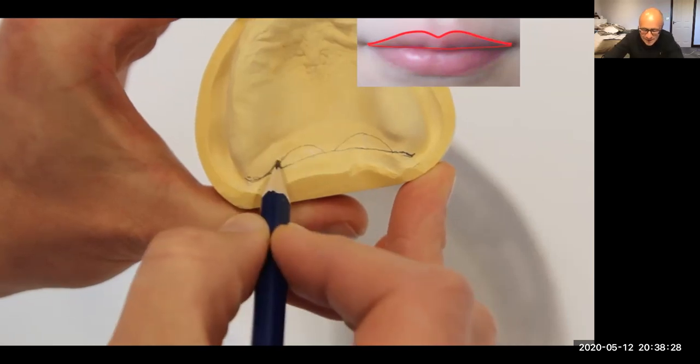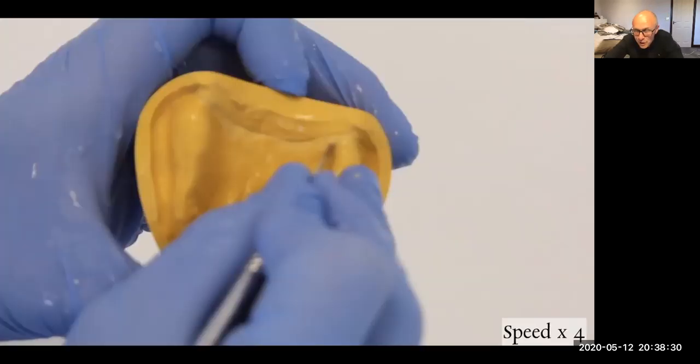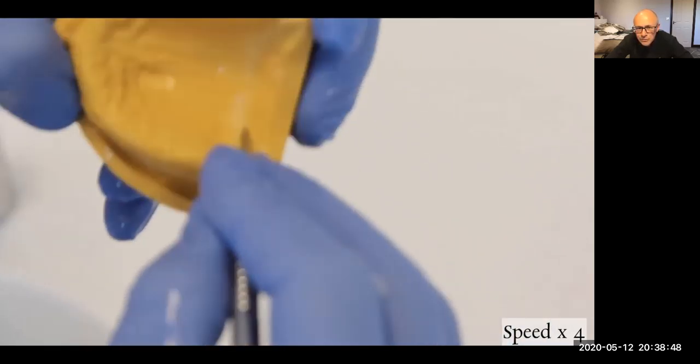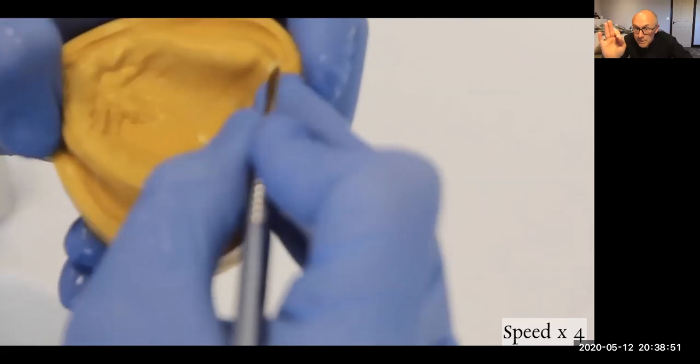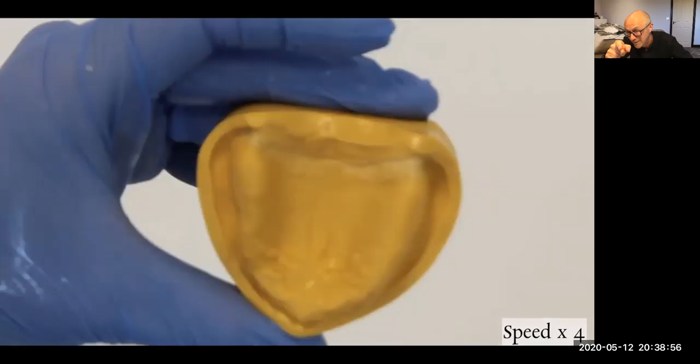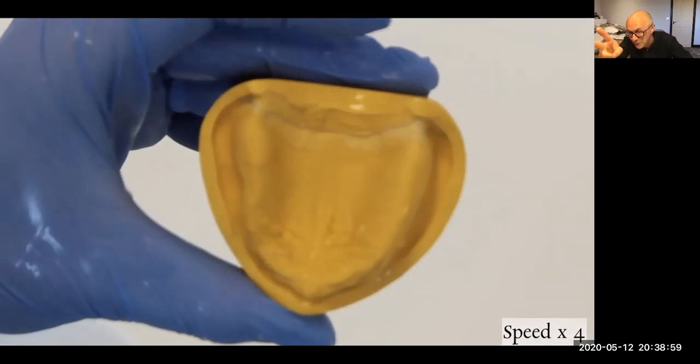So once I've done that, I soak the model in water for about a minute because these definitive models are really hard. They're rock hard. They've got stone in, 50% stone. And then I scratch it out. This is speeded up, but I use one of the tools. The two tools I love using are a Lecron carver, which is this. It's brilliant for prosthetics. And the other one that I love using is a wax knife. They're my two go-to tools. Cut out the post dam like that.